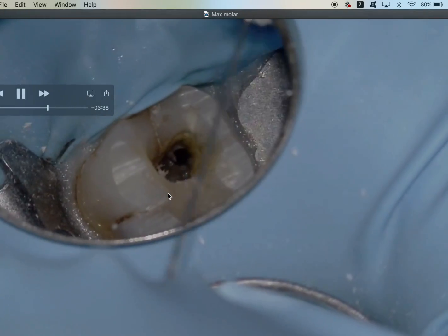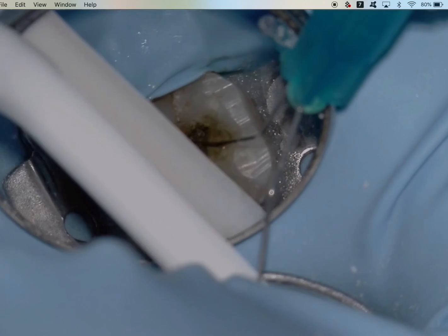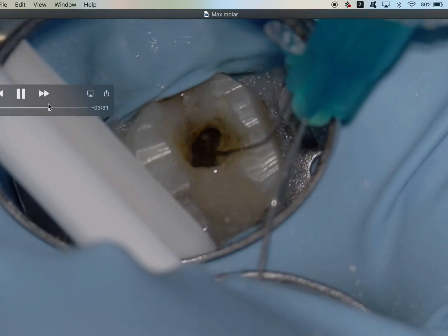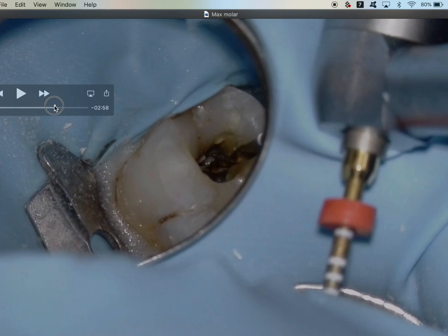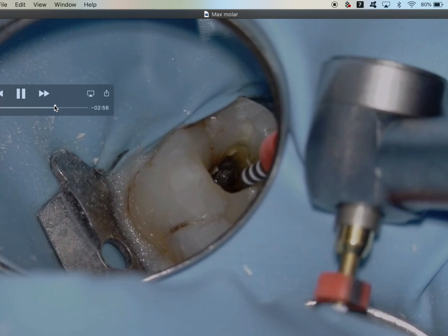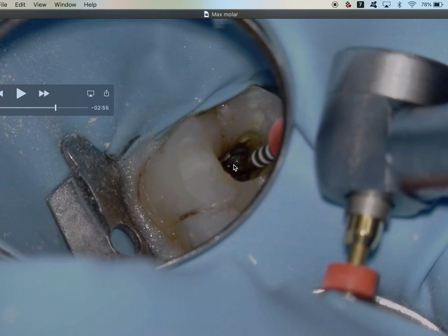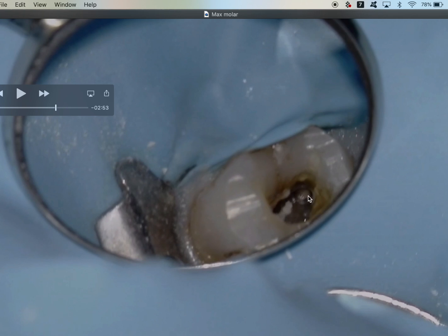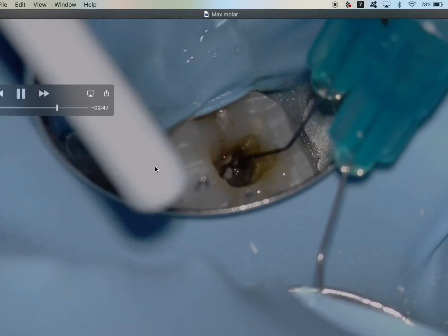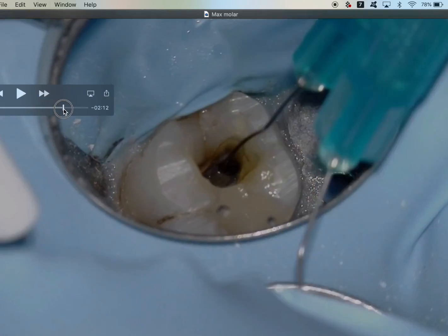That is super cool — we got it! I took a size six file, then a ten file to working length. Interestingly, this canal opens about five millimeters from the orifice, and the dentin debris is actually from the MB2. These two canals join — so what appeared to be a fin is actually a canal — MB2 joins MB1. Irrigate all of that out, and now we know we've got MB2.